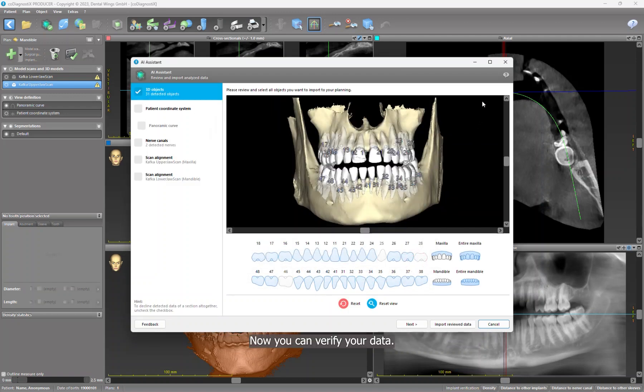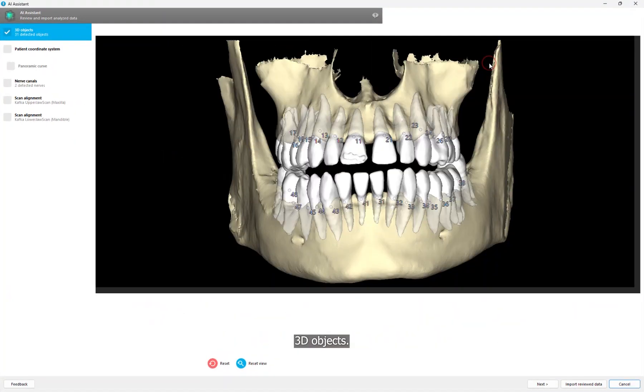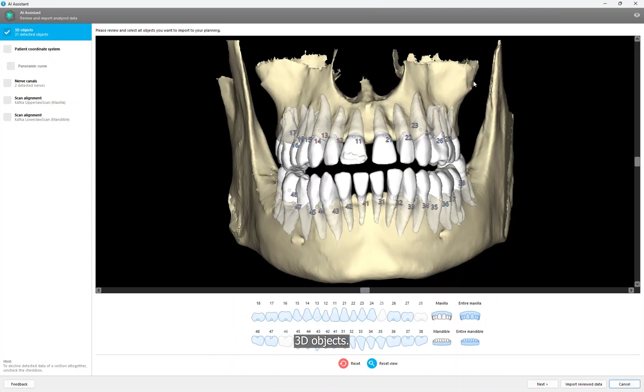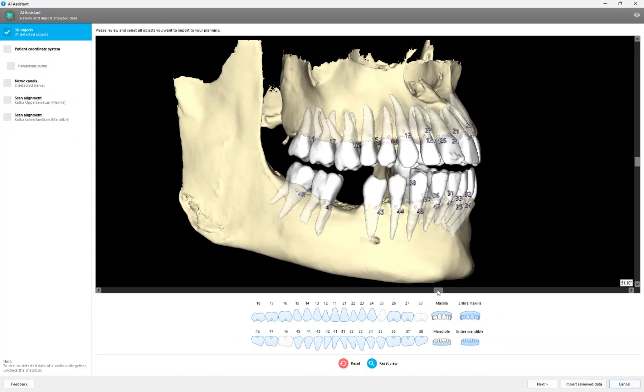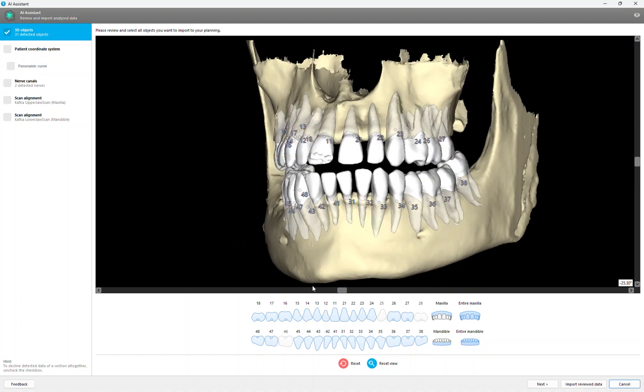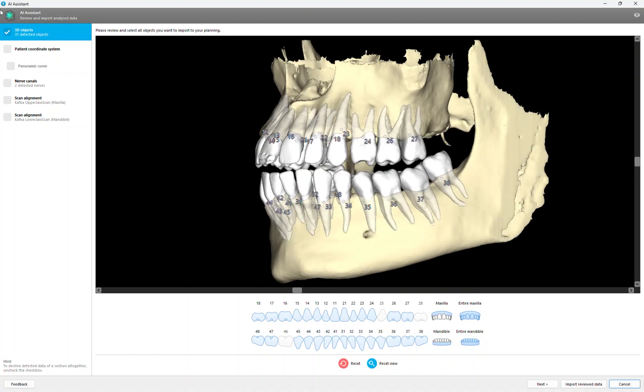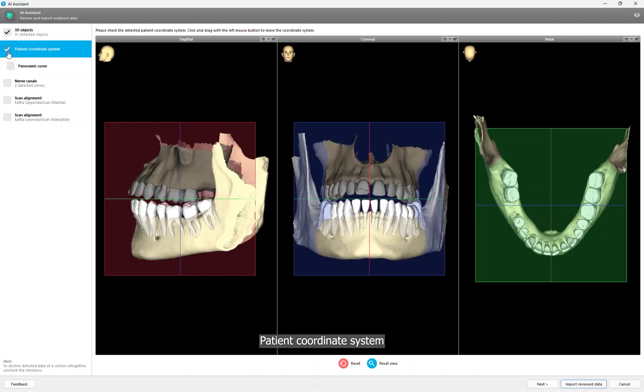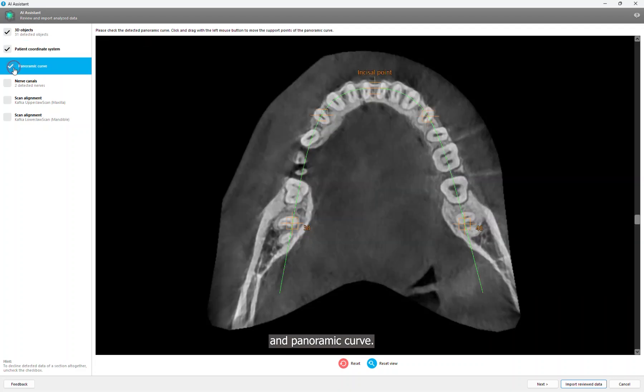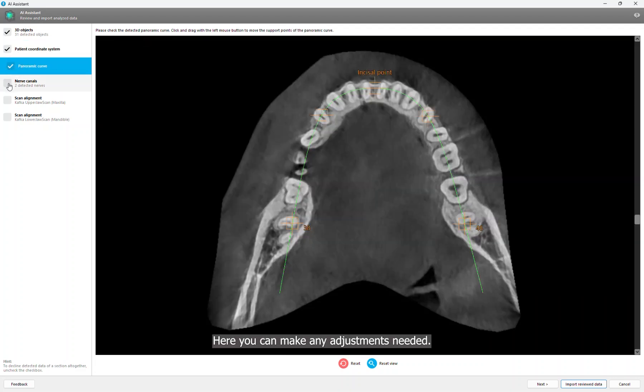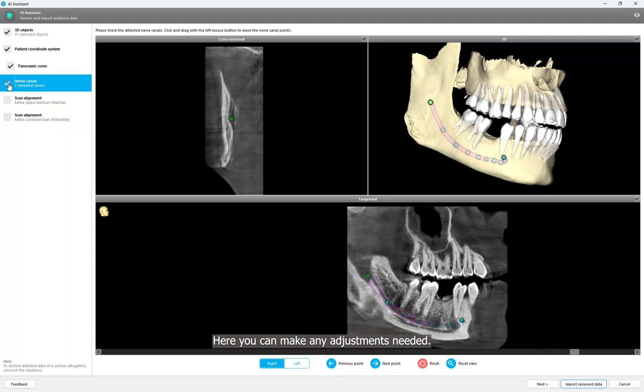Click on the AI assistant icon to review your data. Now you can verify your data, 3D objects, patient coordinate system, and panoramic curve. Here you can make any adjustments needed.